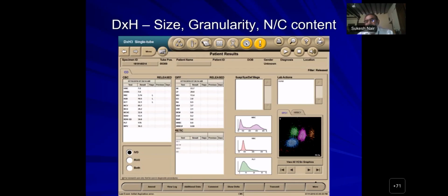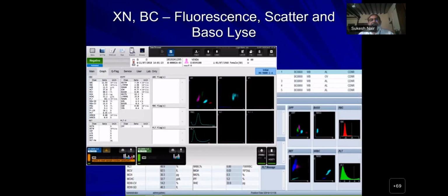They are the eosinophils. Then you have the green population, which are cells which are largest, but they don't have as much scatter as neutrophil, but almost as similar as a lymphocyte. They are the monocytes. Because the nucleocytoplasmic ratio will help identify the basophil population, which is right behind the lymphocyte.